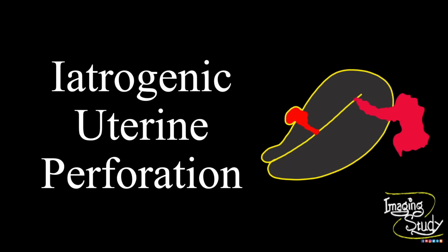Today we are going to show you our 200th case video on this channel. So I will try to make it a little lengthy, not very much. So let's start. Today we are going to see a case of iatrogenic uterine perforation.